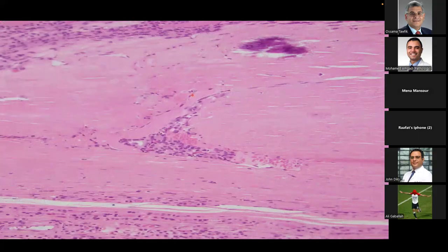Okay. And here's another example. You can see here that it's going into a vessel and surrounded by a vessel as well on the outside. So sometimes there are small areas of vascular invasion or angioinvasion, and it's important for prognostic significance to count these angioinvasive foci.